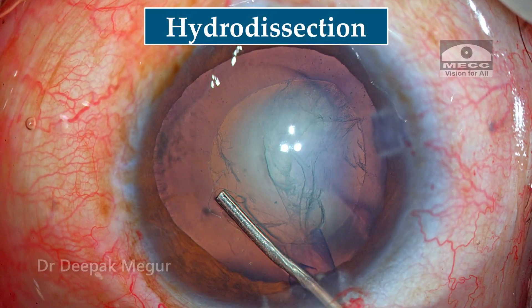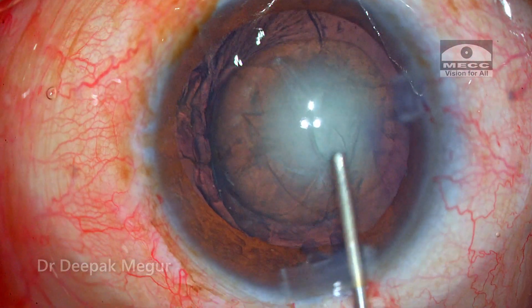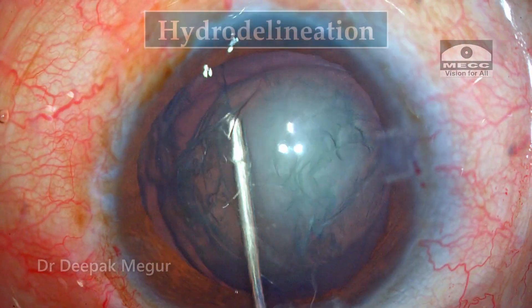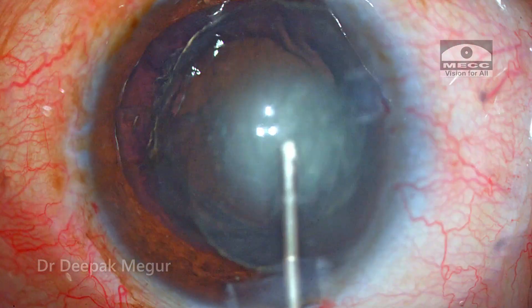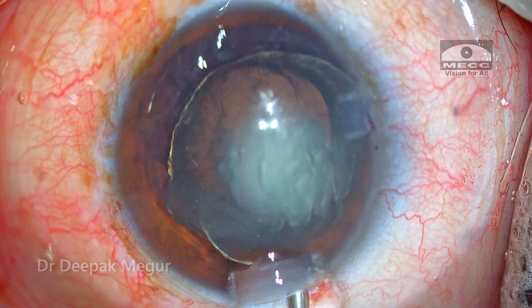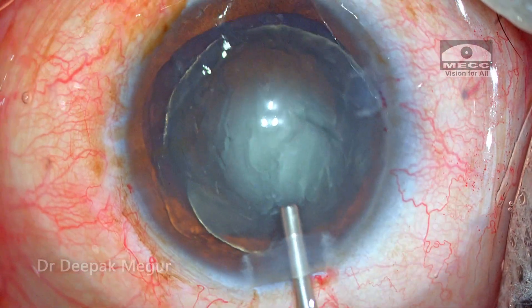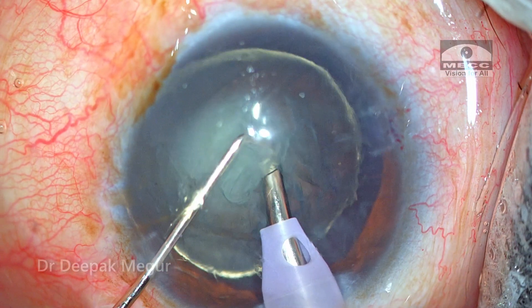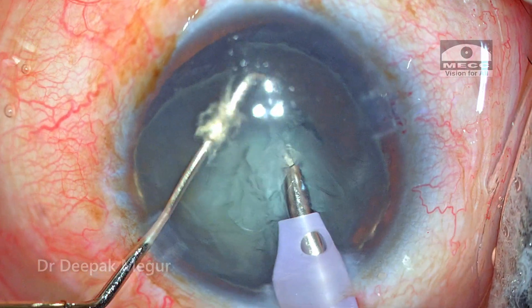Cortical cleaving hydrodissection is an important aspect of surgery in such cases. As I'm doing the hydrodissection I can see the posterior fluid wave, and I'm trying to decompress the bag by pushing back the lens. Now I'm attempting hydro-delineation, and at this point unintentionally the nucleus just pops out of the bag. So I have a nucleus that has prolapsed into the anterior chamber and I need to manage it there. Although I'm attempting to push it back, it's unlikely to go back, so I'm going to emulsify it in the anterior chamber under the cover of OVD.